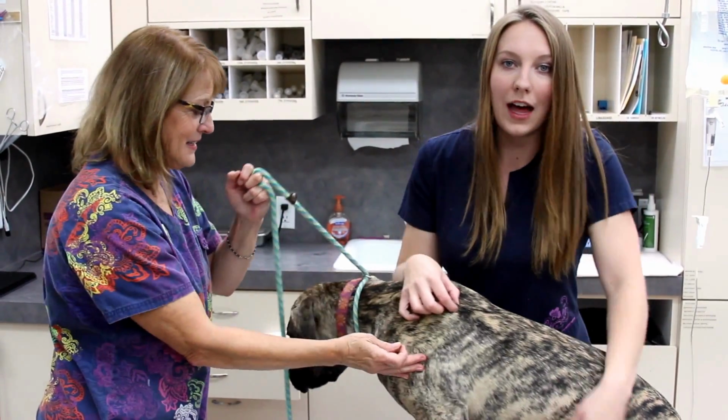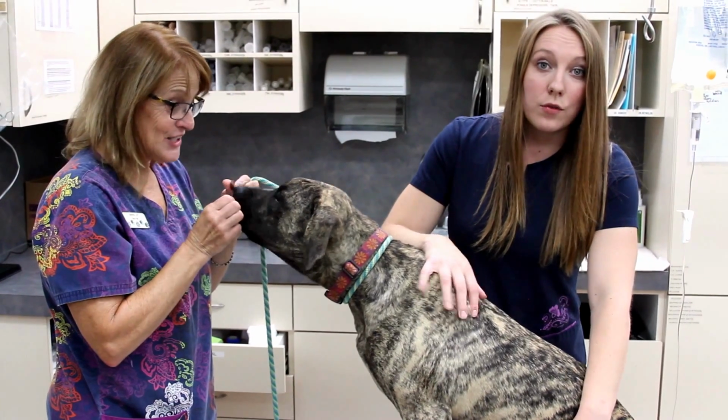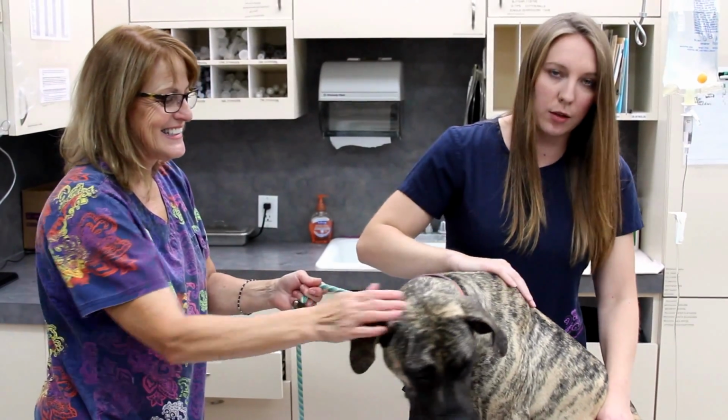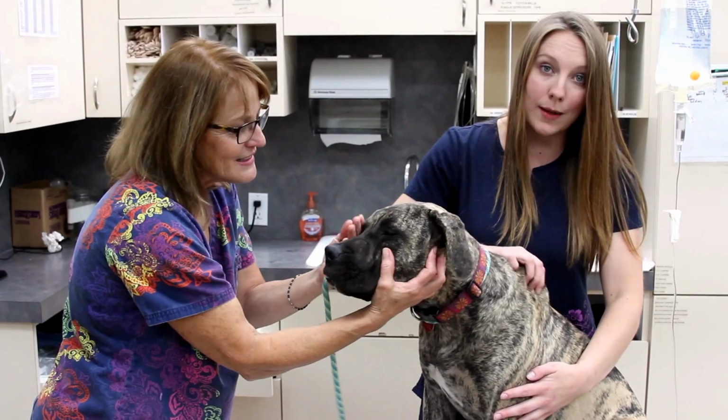You can leave the old needle on, but just make sure you replace it with a new needle every time you give sub-Q fluids. You may find a little bit of leakage out of that hole where the needle was inserted. That's totally normal. Just take a little bit of gauze or Kleenex and just put a little bit of light pressure on there. Hopefully these tips were helpful for you guys.